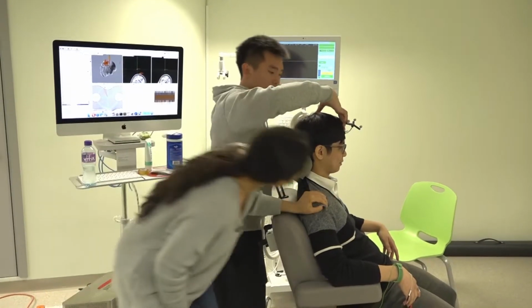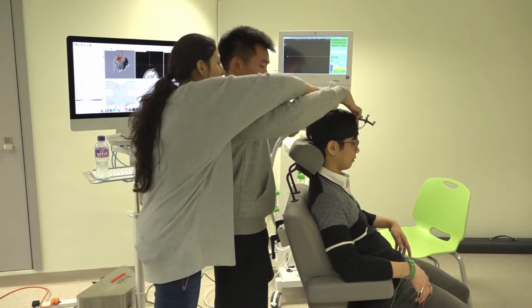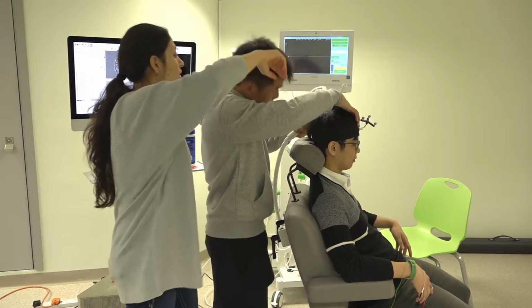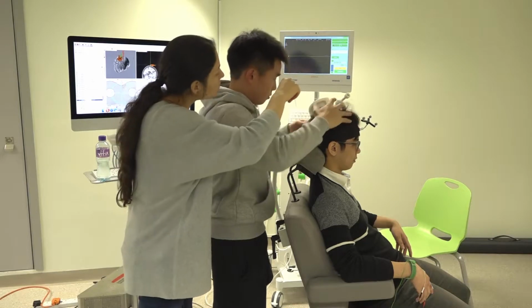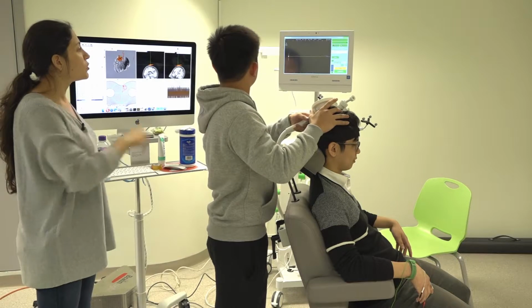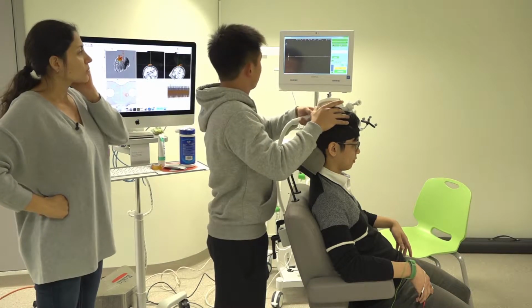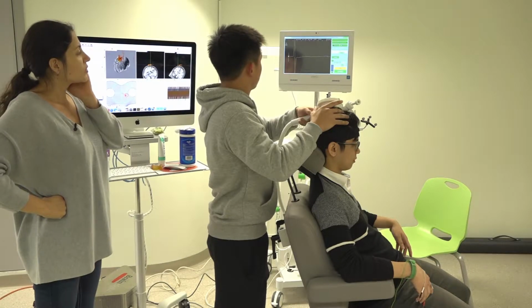How are you? Are you fine? So from there, and it will be like a third, right? Yeah, somewhere. And the center of the coil should be a little bit, yeah, exactly. Yeah. Just check, you find your spot. Good.